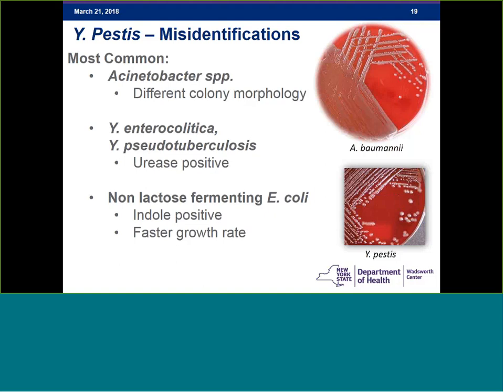Yersinia pestis may not be identified in common automated ID systems, including MALDI-TOF, and additional possible misidentifications may include Shigella species, non-sulfur producing Salmonella species, and some Pseudomonas species.